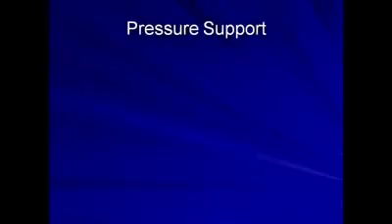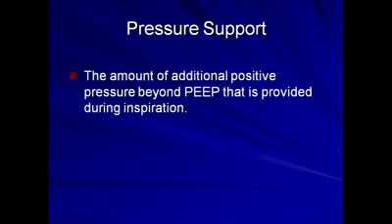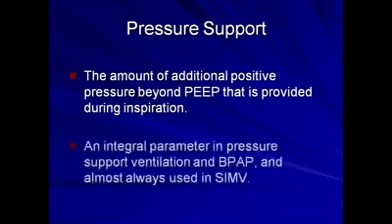The next option to discuss is pressure support. This is the amount of additional positive pressure beyond a PEEP that is provided during inspiration. It is an integral parameter in pressure support ventilation and BPAP and is almost always used in SIMV.